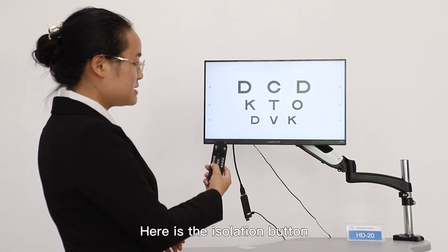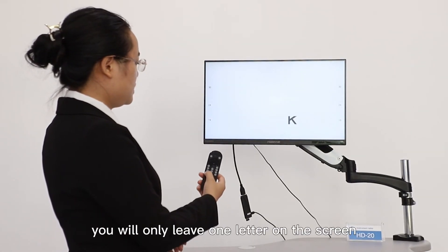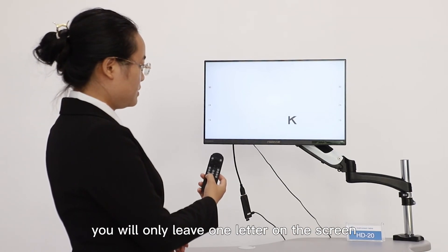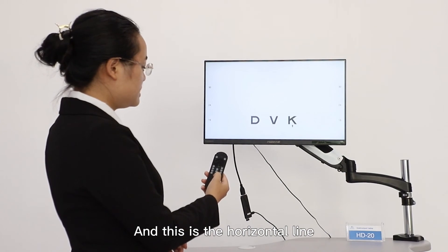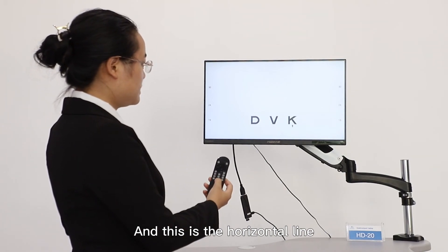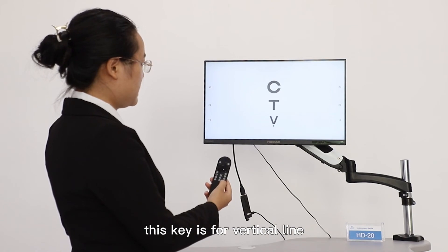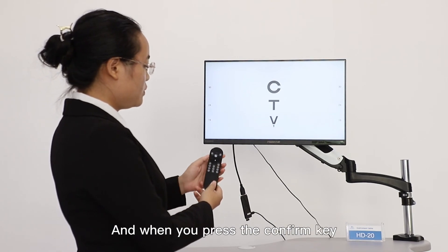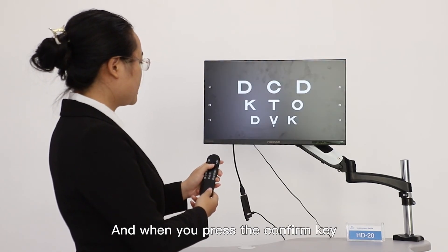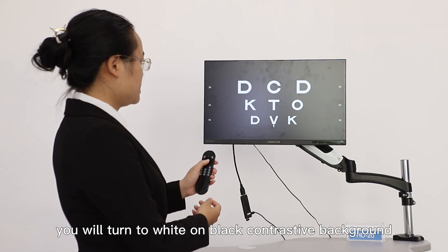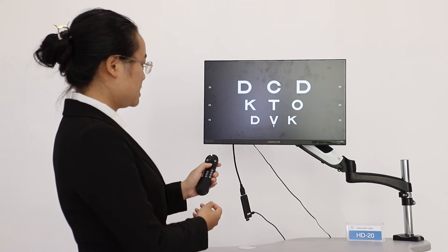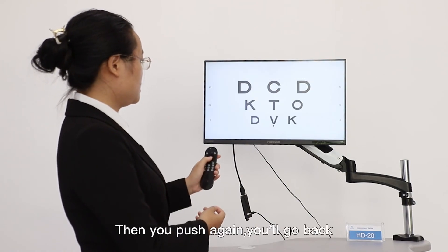Here is the isolation button. You will only have one letter left on the screen. And this is the horizontal line. This key is for vertical line. And when you press the confirm key, you will turn to white on black contrast background. And you push again, you will go back.